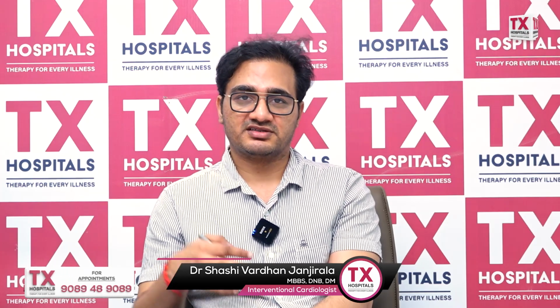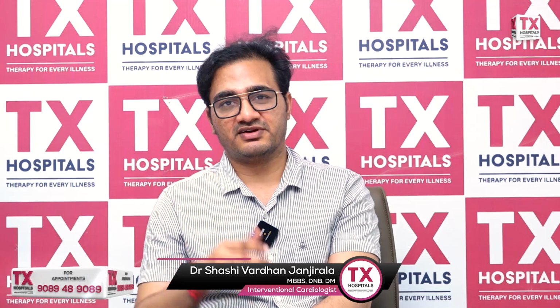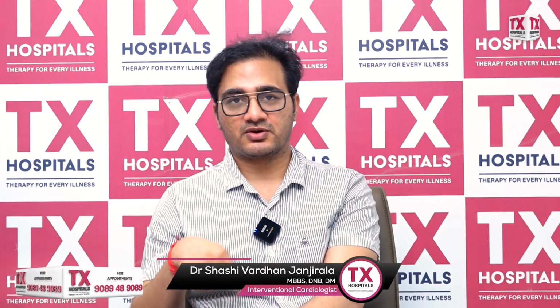They will advise some renal Doppler. If there is some problem in the renal arteries, they will refer the patient to us. We will put a stent across the renal arteries, either going through the groin or through the radial vessels. This is another indication where we put a stent.